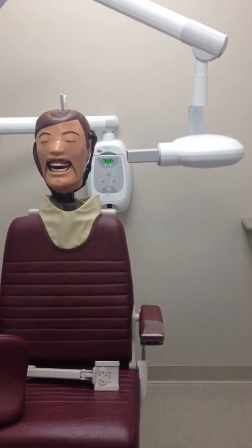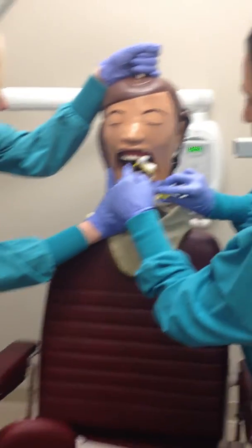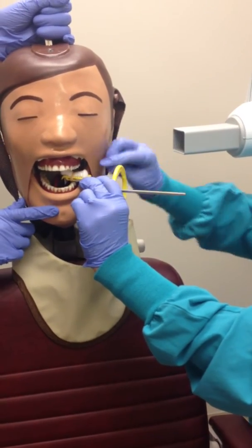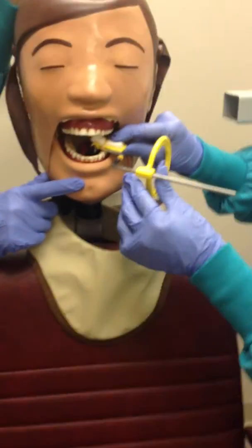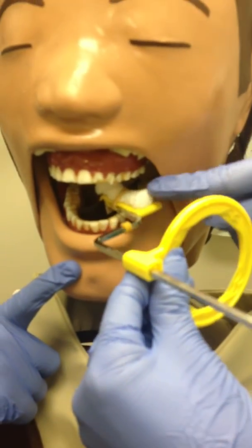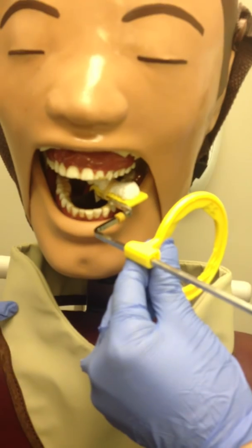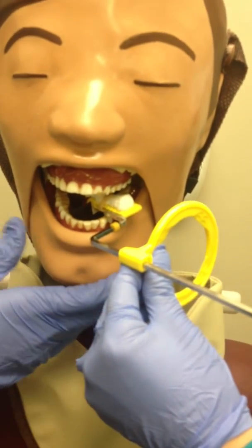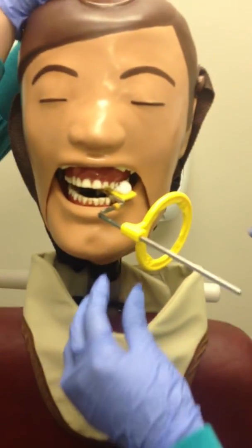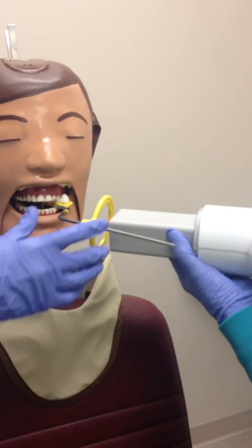Place the bite block with the cotton roll facing the maxillary arch. Insert with the film parallel to the mandibular arch for patient comfort. The bar should be coming out of the patient's mouth. Place the film between the two premolars and include the distal half of the canine. Make sure to include the crown of the tooth, apex or roots, and surrounding structures. Maintain an equal tooth-film distance along the entire length of the film. Instruct the patient to bite down and not move in order to prevent blurring of the radiograph. Slide the ring down on the rod until it approximates the skin without touching the patient.